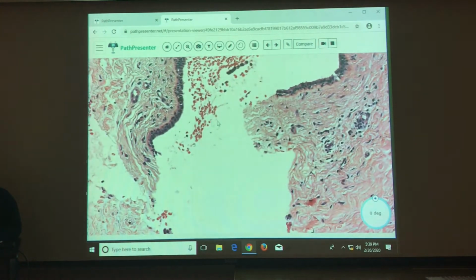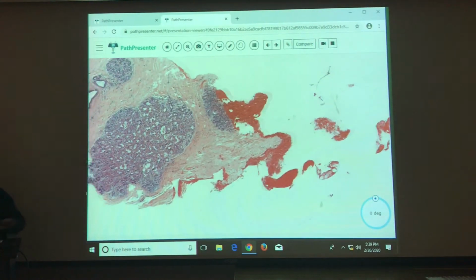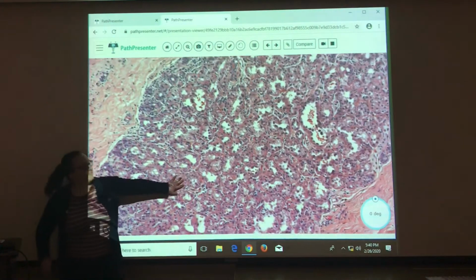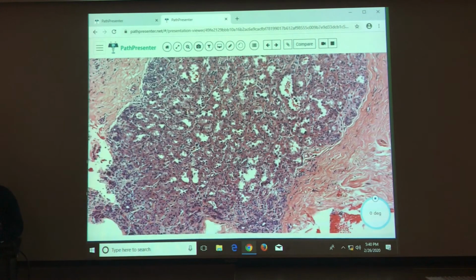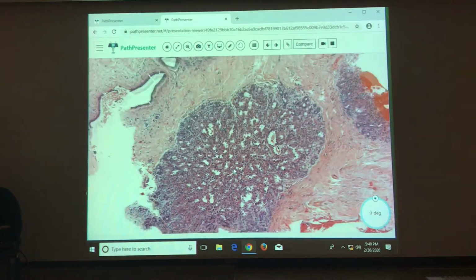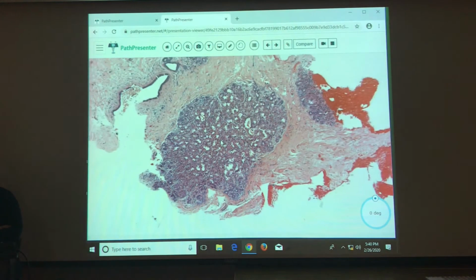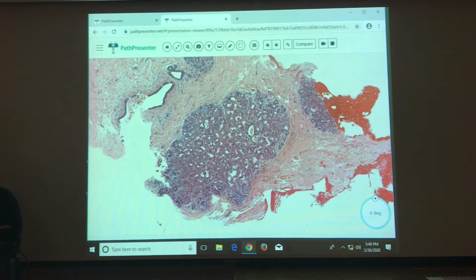It's not this thing, is it? No, that's normal. Yeah, that's good. It's a lot of ducts kind of back to back. Yeah. Doesn't really seem to have a pattern. It seems to be a little haphazard, I would say. Okay. Yeah, I'm pretty squished in there.